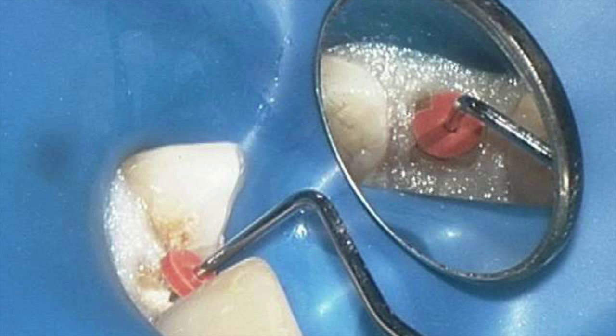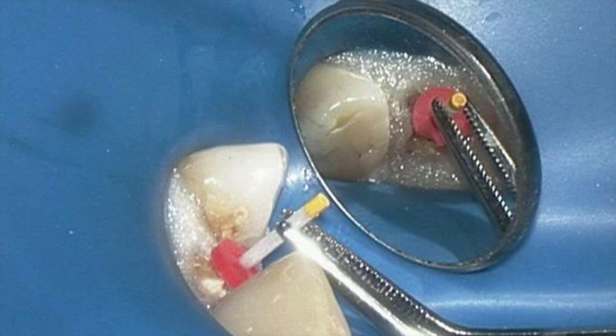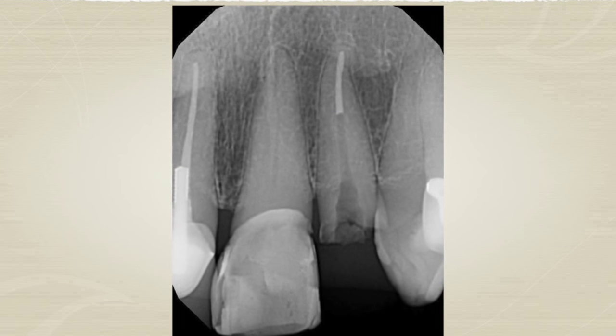What you can do is lightly heat up the interface of the gutta-percha so that you can condense it down, ending up with gutta-percha 360 degrees all around the canal at the apical area of the post, so you don't have any unset sealer exposed. But if you're not planning on cementing the post right away, you can just condense it cold and then complete the case. Here I show that the post is then refitted to make sure it's seated to the end. As an endodontist, I don't cement the post myself — I send it to my referring dentist who proceeds to cement it. And this is the final x-ray showing the post space has been prepared and the case has been obturated.